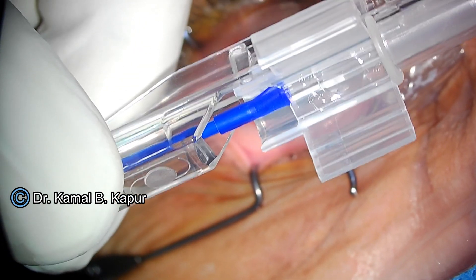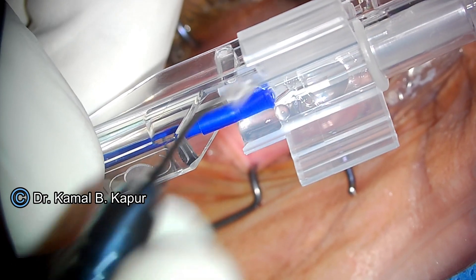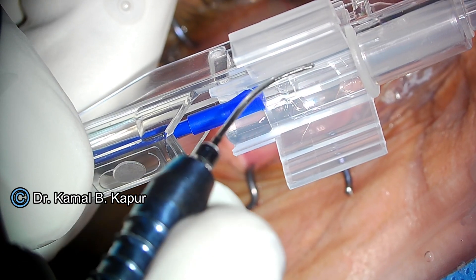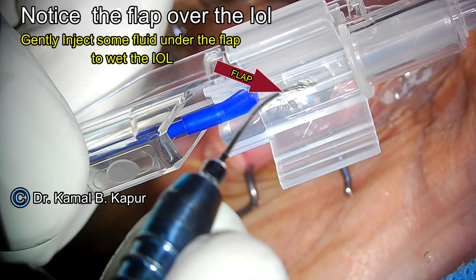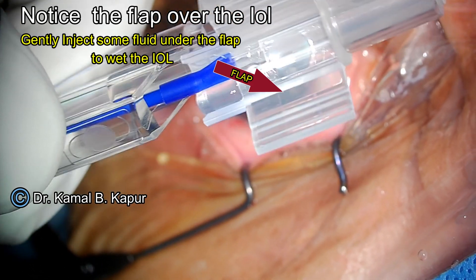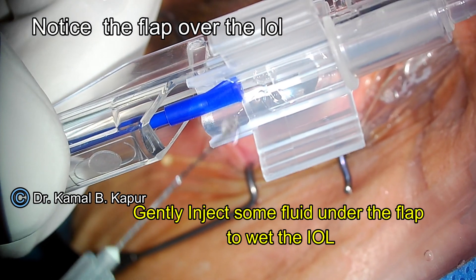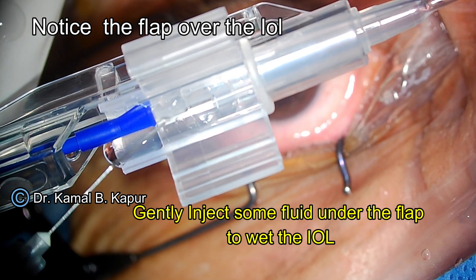Never remove this cover, because we may be in the habit of removing flap covers from some other pre-loaded lenses available in the market. The four-haptic IOL is covered with a flap on top, which ensures that the lens does not move around.